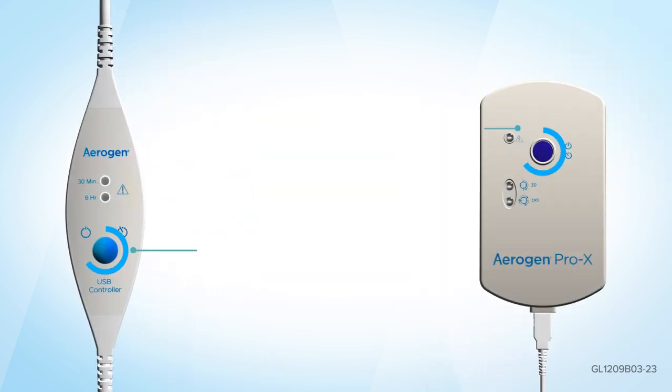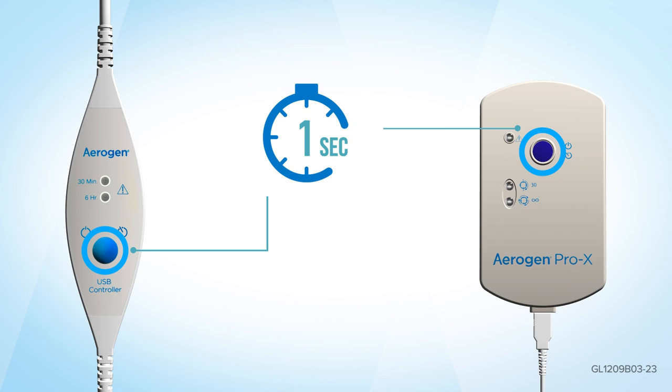Press the on/off button on either the Aerogen Prox controller or Aerogen USB controller for one second to select the 30 minute mode.